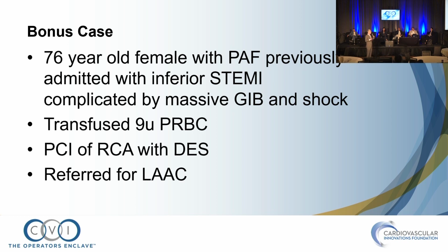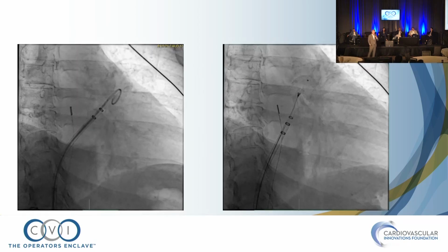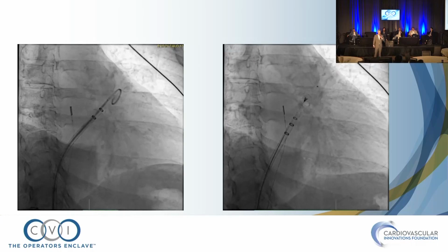And then after all of this, some 2-3 months later, got sent for left atrial appendage closure because now the patient has indication for prolonged antiplatelet therapy and a massive GI bleed from anticoagulant therapy. And we did a Watchman device.